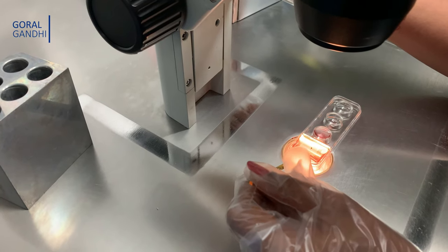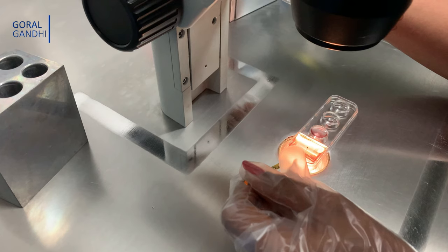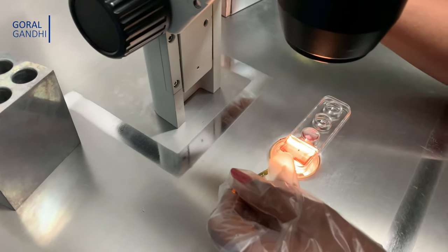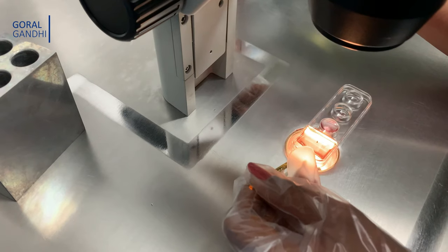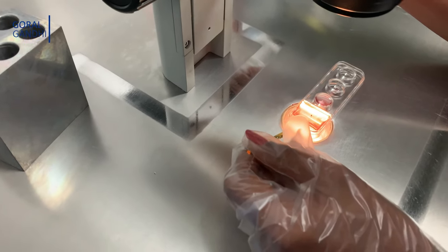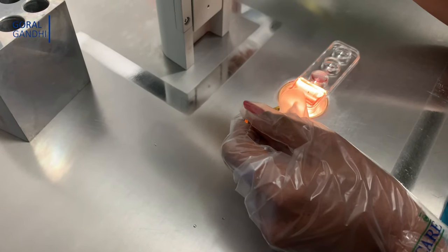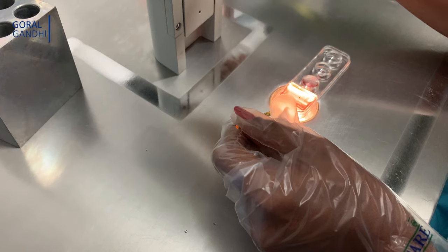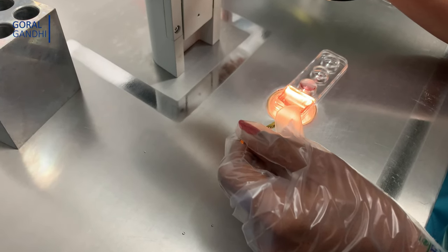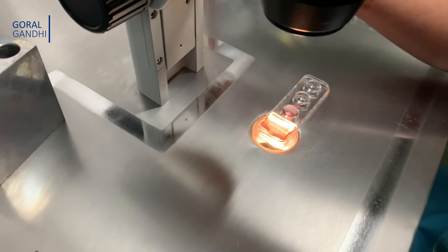It is very very important to keep your hands still and not be in a hurry to move out the Cryotech before one minute is over. Most injuries can happen in this step, so make sure that this step is performed very very efficiently. Once the one minute is about to get over, very gently from the sides take out your Cryotech. Thank you very much.